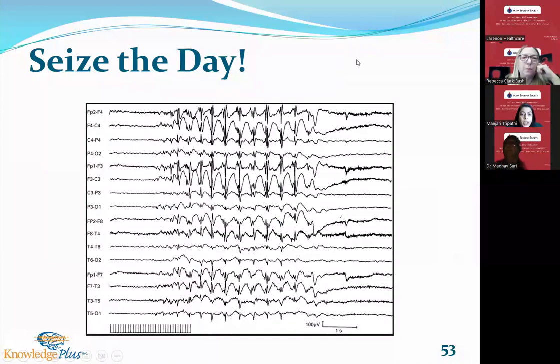There's one question. Can we do it if an EEG shows epileptiform discharges without activation? This is by Eugene Shamba. So suppose an EEG is showing discharges prior to the hyperventilation, would you still want to go ahead with the hyperventilation? This is an excellent question. And a question that as a newbie, you kind of wonder, do I not go further? The truth is a patient can have more than one focus, can have more than one seizure type. And if we don't do everything we can to tick all the boxes, we really could be medicating incorrectly.